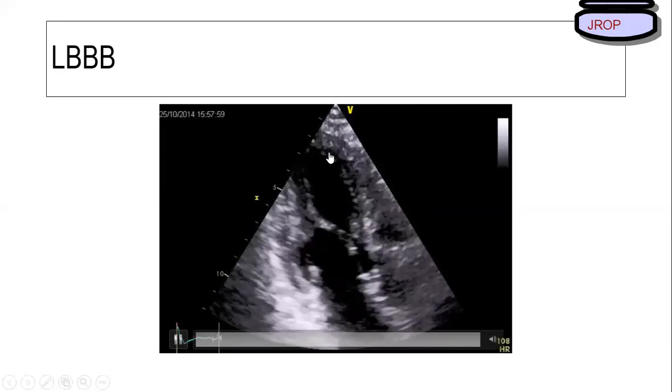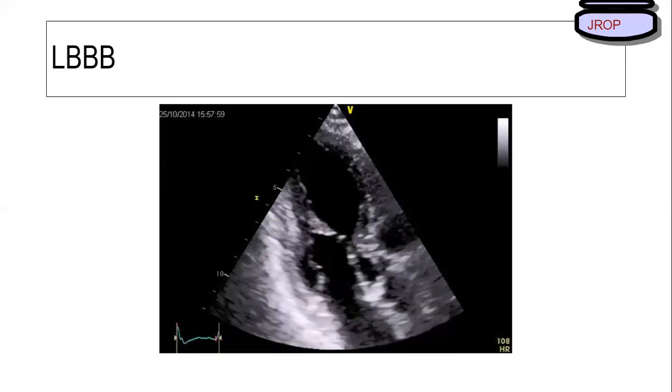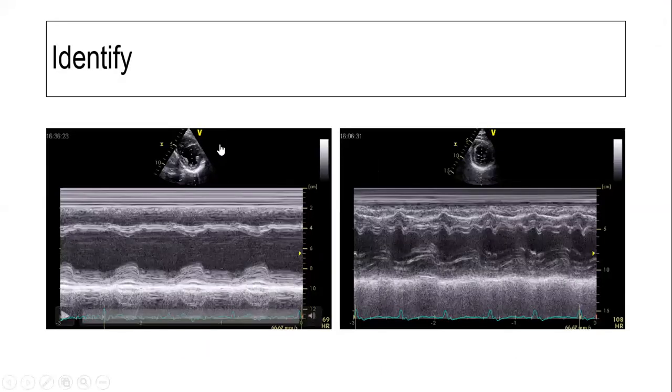This is septum, but this is thickening. You have to be very cautious. This is thickening, first point. If you do an M mode in the plax window of the same patient, what will happen? In M mode of the same patient, I have done this in the anterior septum. It'll show this kind of a beaking pattern in M mode with thickening. But if it's hypokinetic, this will not show a beaking pattern. This will show a thinned out septum.